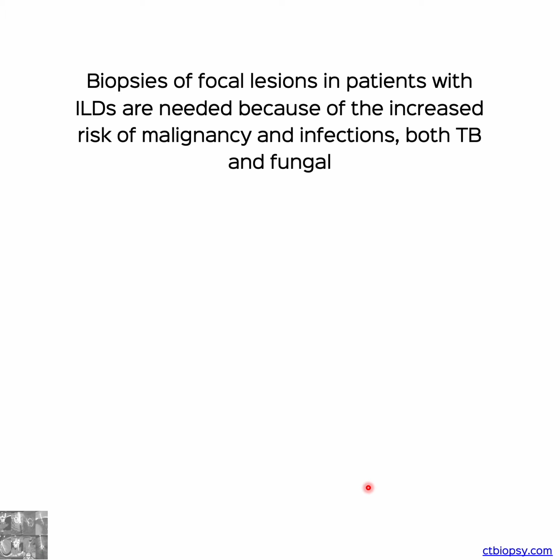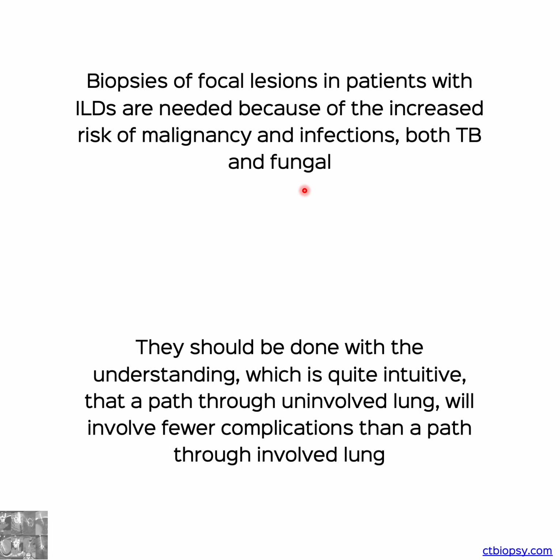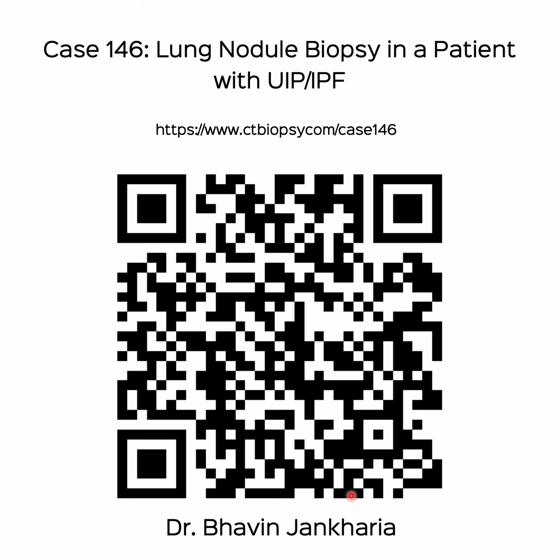Biopsies of focal lesions in patients with ILDs are required because of the increased risk of malignancy and infections. They should be done with the understanding, which is quite intuitive, that a path through uninvolved lung will involve fewer complications than a path through involved lung.